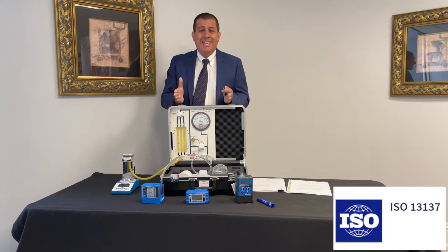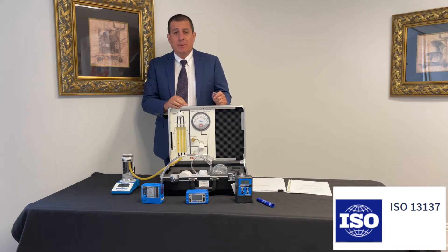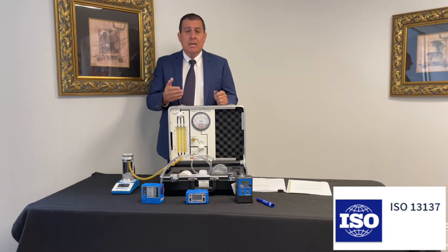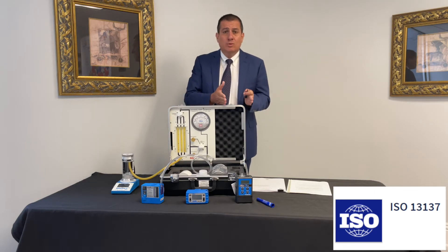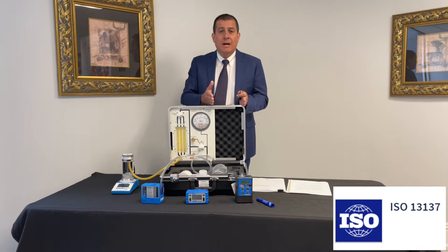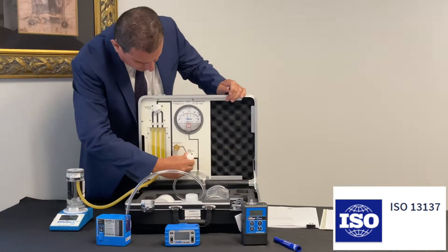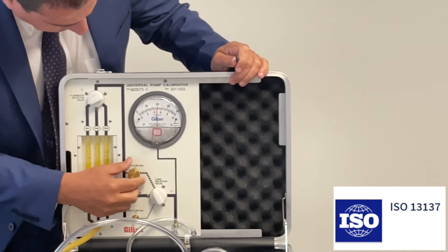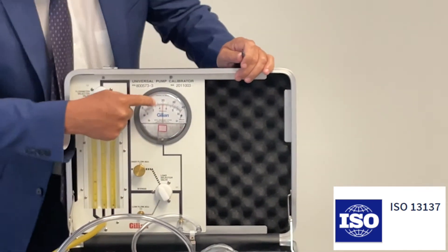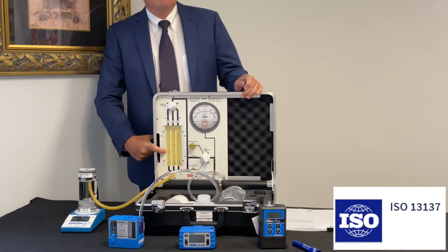We could do this test with any sampling pump — it could be any brand, any sampling pump in the marketplace — but it's important to check whether this pump is able to work with the back pressure that you will find in a work environment. So let me apply back pressure here. As we increase, you can see 20 inches of water, and the flow is still at two liters a minute.